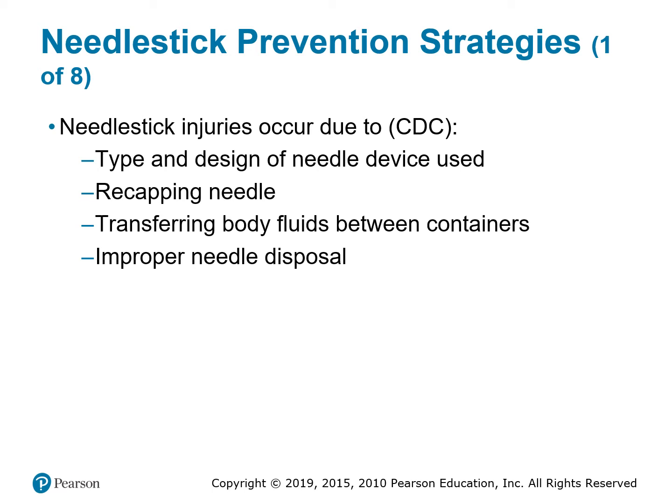Another thing, as far as when we are phlebotomists, the biggest thing besides hand hygiene that we have to worry about is needle stick precaution. So basically what needle stick precaution is, different ways of handling how we handle the discard or the use of needles. As you know, we have different types of needles. We have the evacuated tube or eclipse system of a needle. We have the butterfly needle or the wing infusion set. And then we have a hypodermic needle, which you use with a syringe. Those are the three methods we use to do venipunctures.